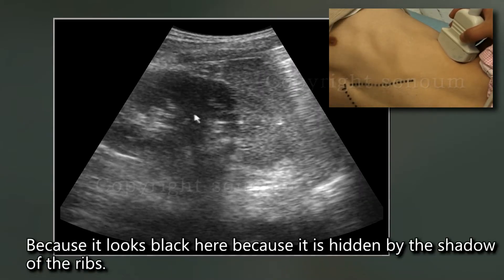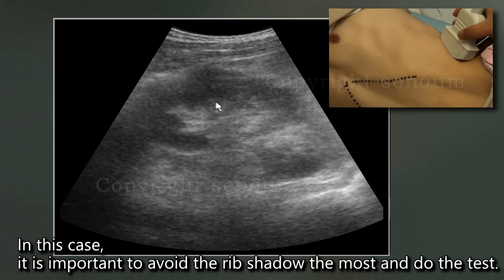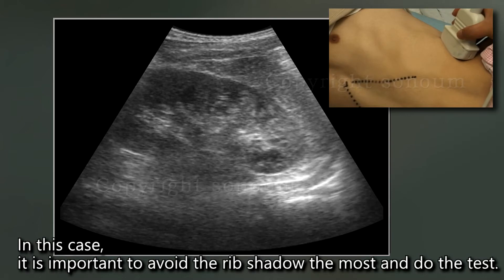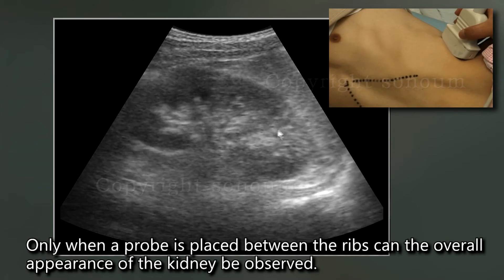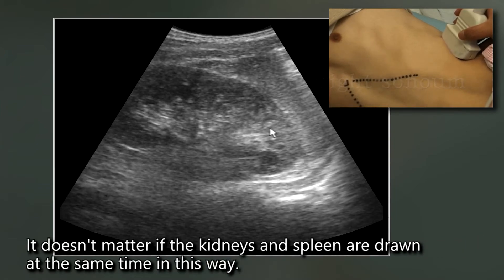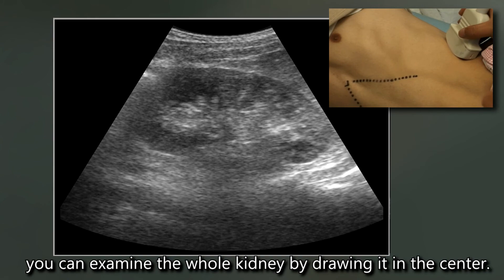It looks black here because it is hidden by the shadow of the ribs. It is important to avoid the rib shadow the most when doing the examination. Only when a probe is placed between the ribs can the overall appearance of the kidney be observed. It doesn't matter if the kidneys and spleen are drawn at the same time. You can examine the whole kidney by scanning it in the center.